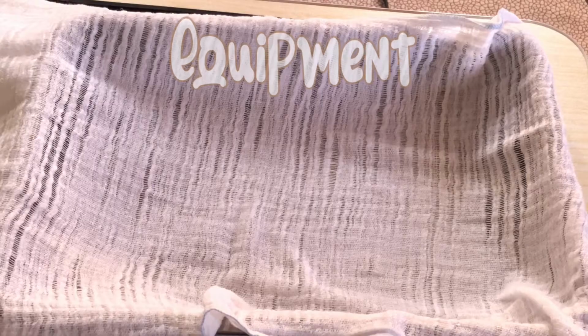Assess the appearance of dressing for integrity, moisture, and need for change, and also the date and time of the previous dressing change. Determine primary care provider's order for changes in fluid administration. Then we will now assemble equipment.